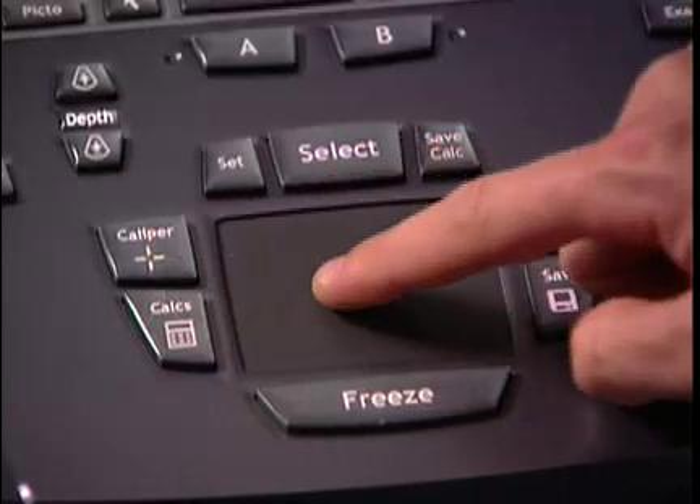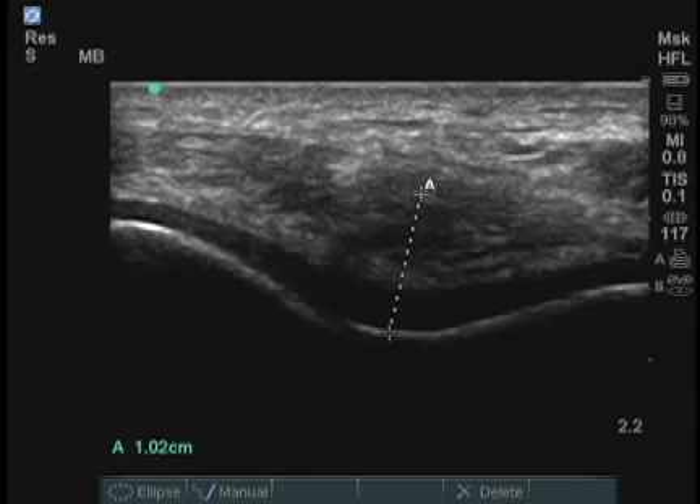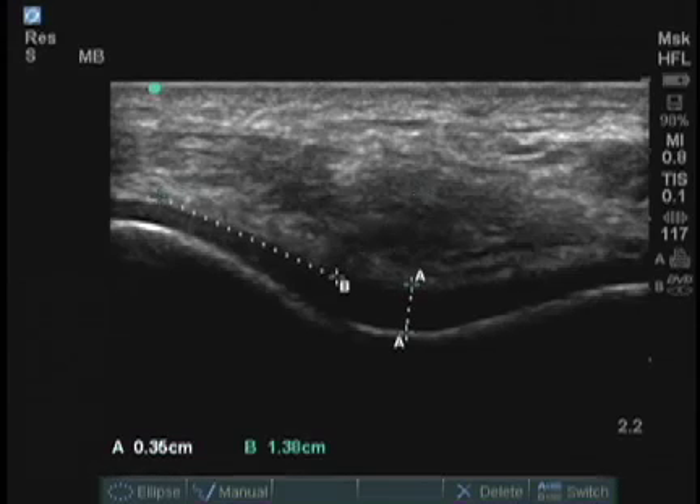I press the caliper button and locate the center of the cartilage, and I can measure the distance of cartilage thickness. I can measure the cartilage thickness at the point of each lateral condyle and compare these to normal values.